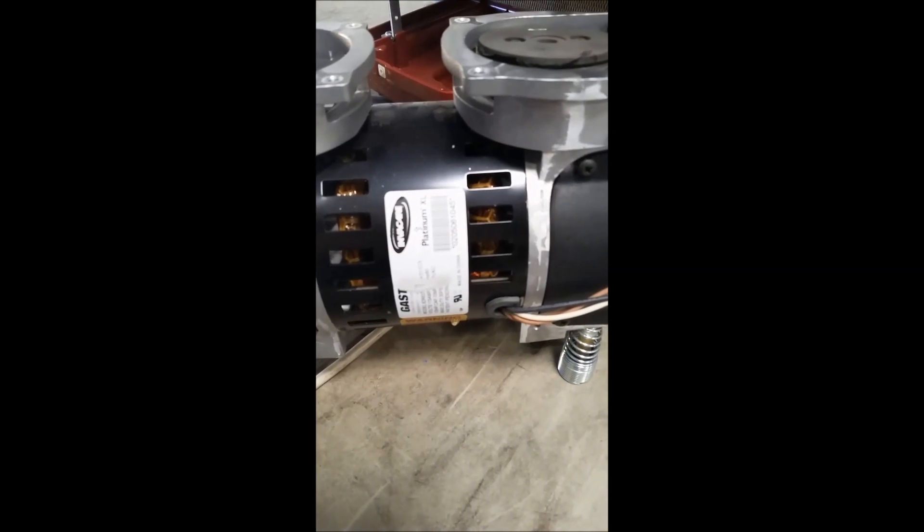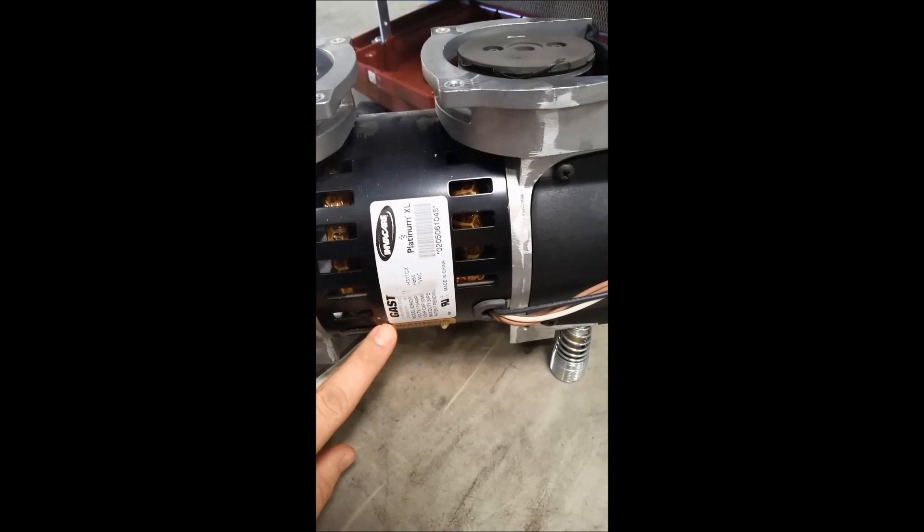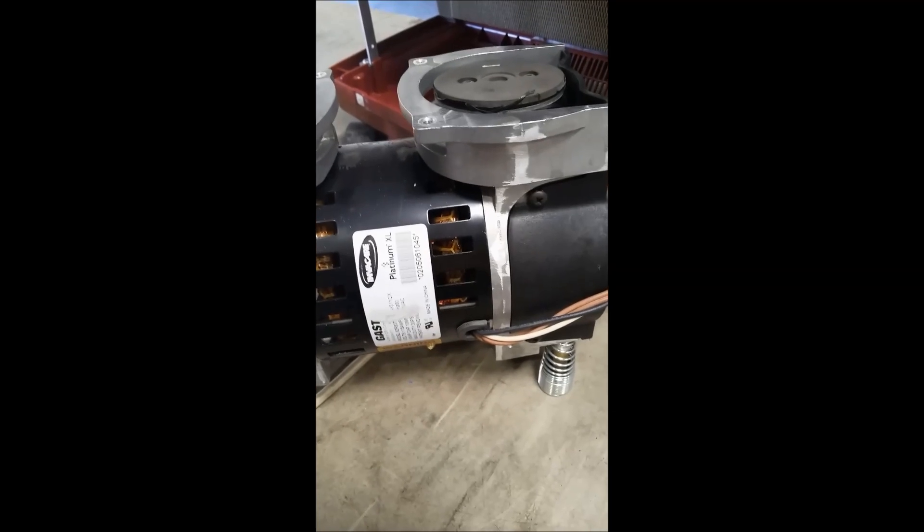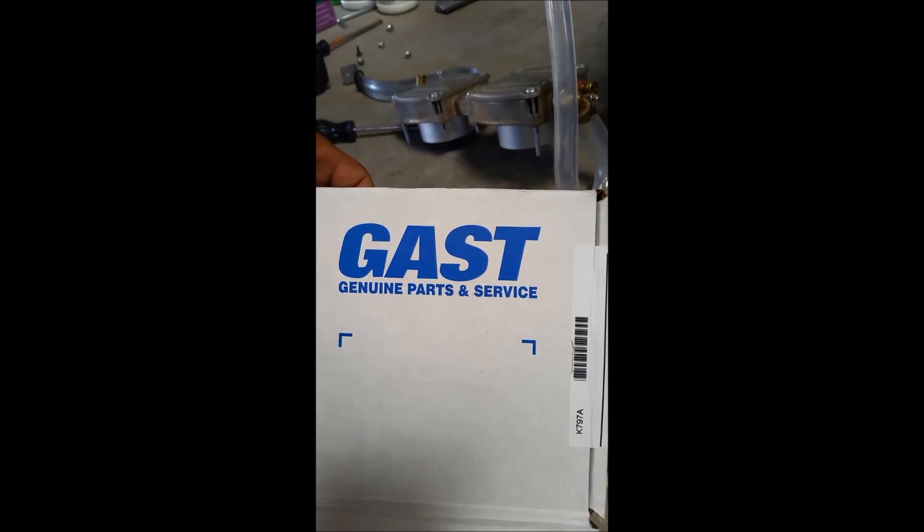There are two types of compressors that you will have to rebuild. Both will tell you right here which style of kit you need. You can see this is a Gast compressor; the other style is a Thomas compressor. Your Gast compressor kit will look like this, and this is the Thomas compressor rebuild kit.